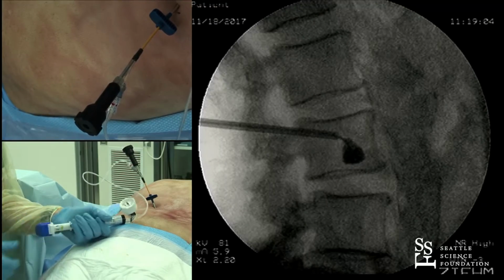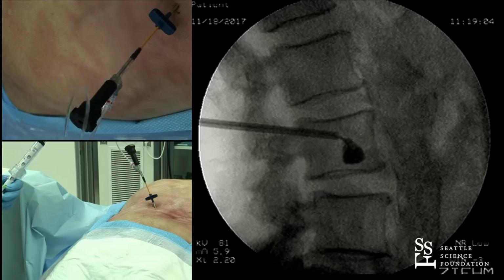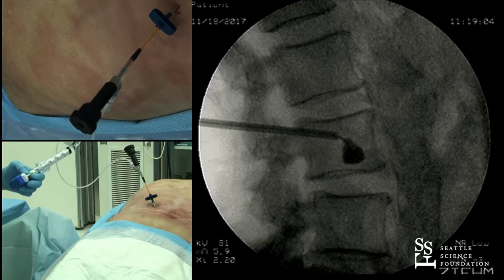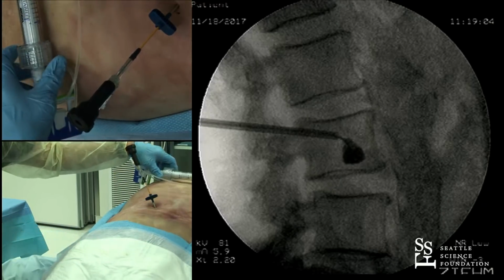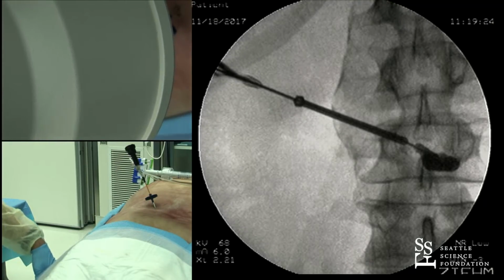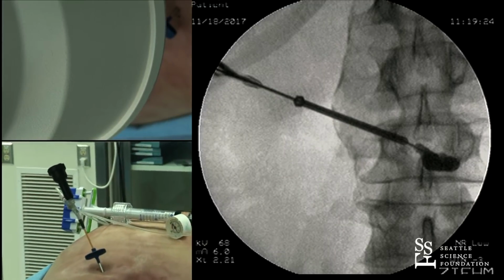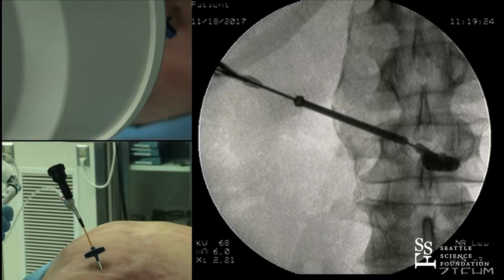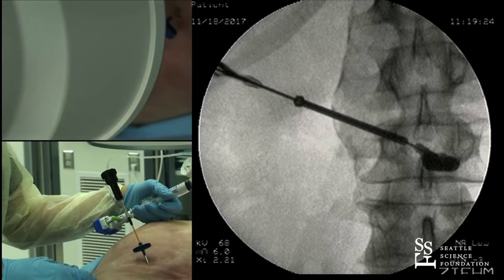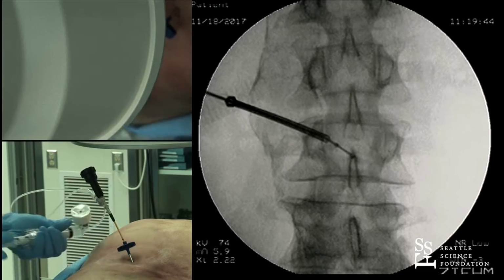Like that a lot. Okay, let's take a shot AP and see how we're doing there. So the curved needle approach with the curved balloon, and the curved balloon is even more across midline, and this is just fine. What we'll do is I'll pull it down, and I'll balloon even more proximally, and we'll get a balloon formation there and there.